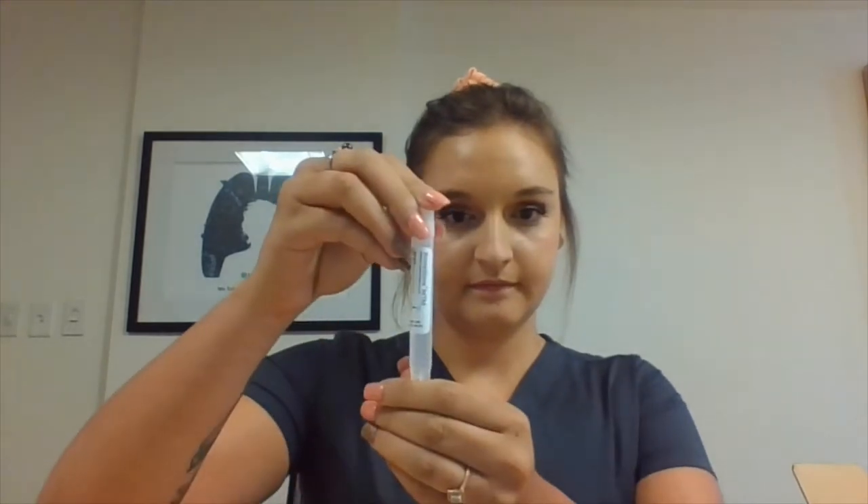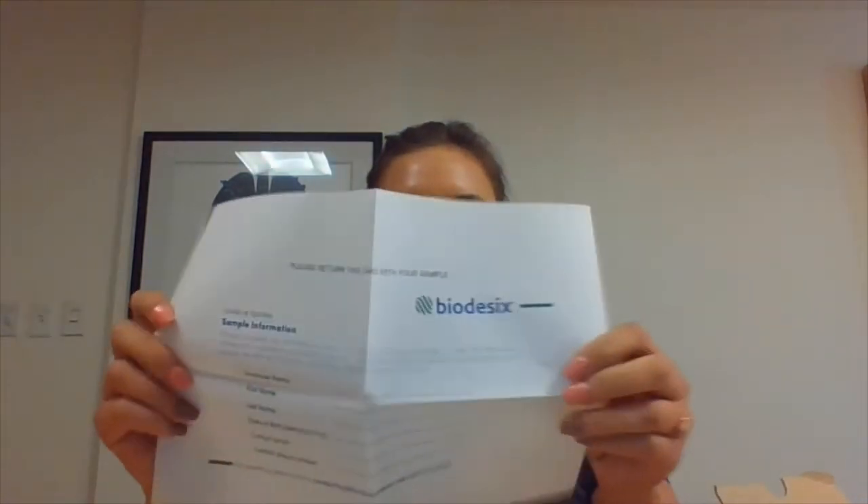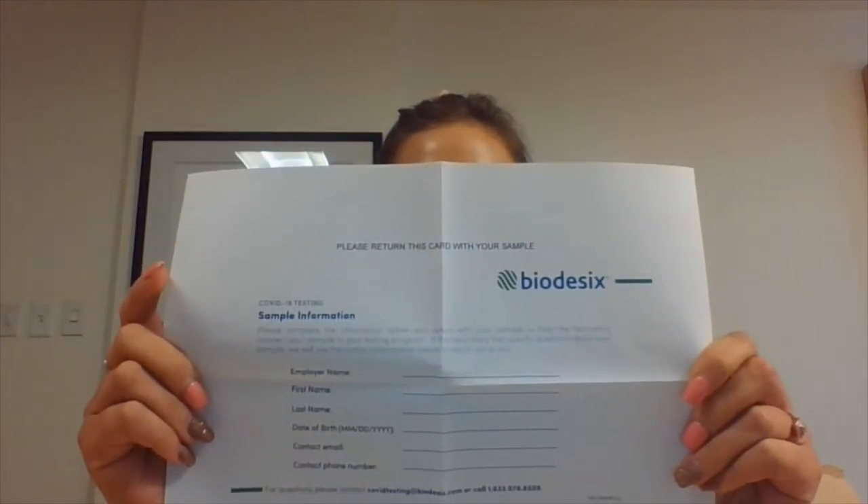A biohazard bag. Inside this biohazard bag you will find your collection swab, a collection tube, a sample label, and a second biohazard bag. The second bag will be used to return your sample — you can set the first one aside. You will also find your sample information card. This card will be used to identify who the sample belongs to at the lab.